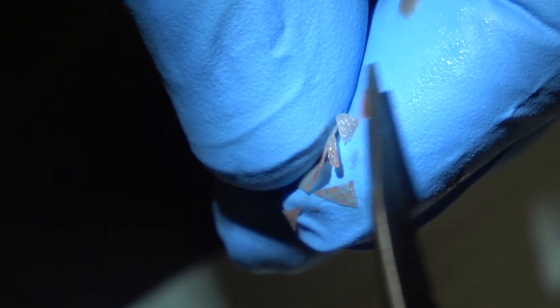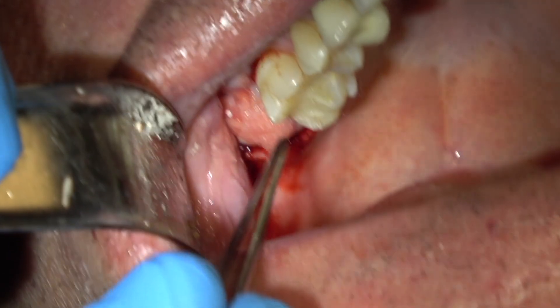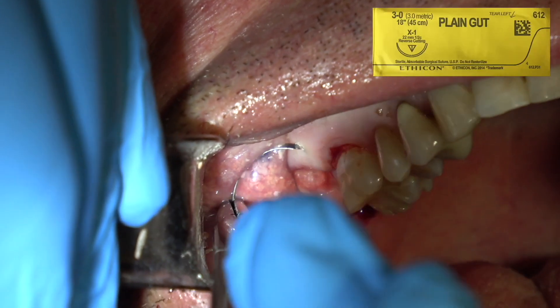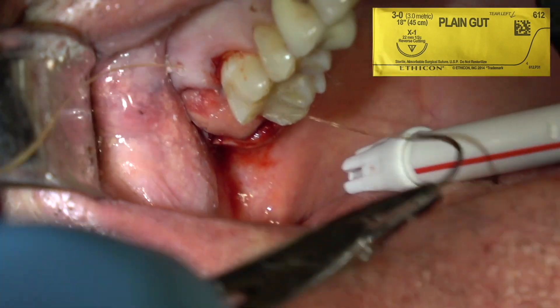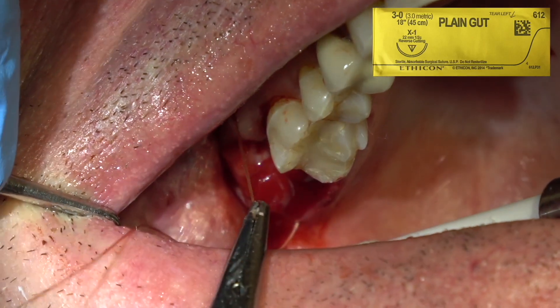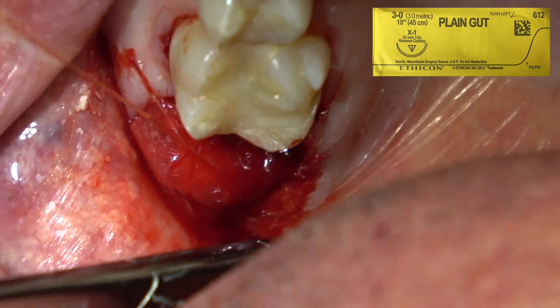You don't want to make it just fit on top of the graft — you want to tuck it under the palatal and the facial flap. Here it is in place, and this is 3-0 gut suture. Place one on the mesial, one on the distal, and then one in the middle on the facial. If I have releasing incisions, I'll place 4-0 gut suture to close the mesial and the releasing incision.